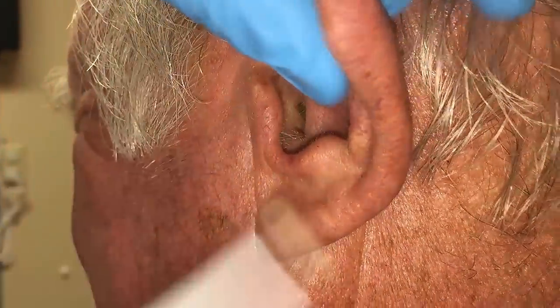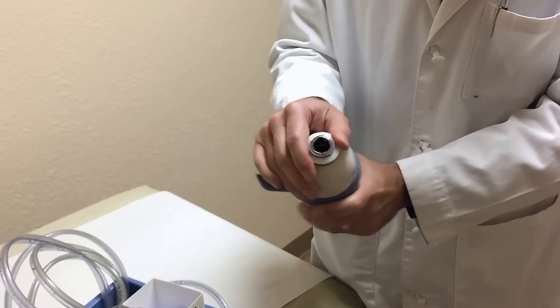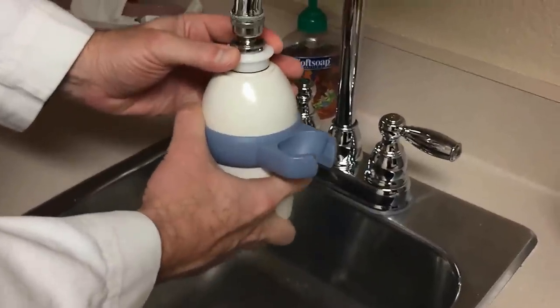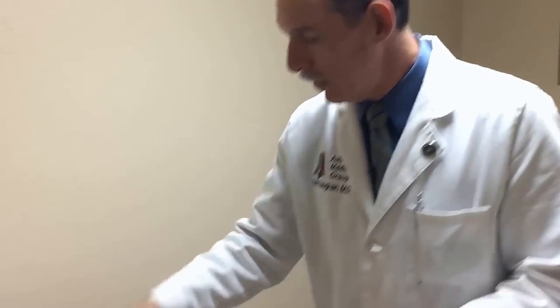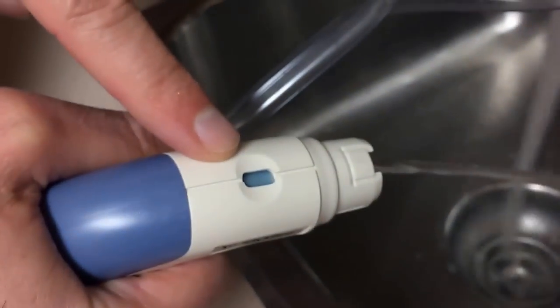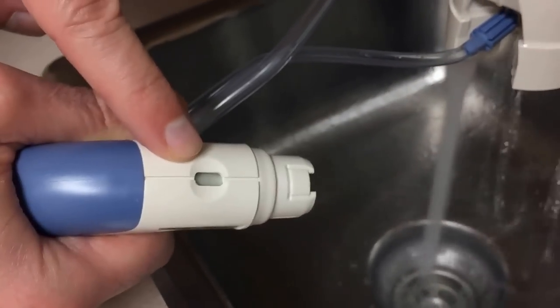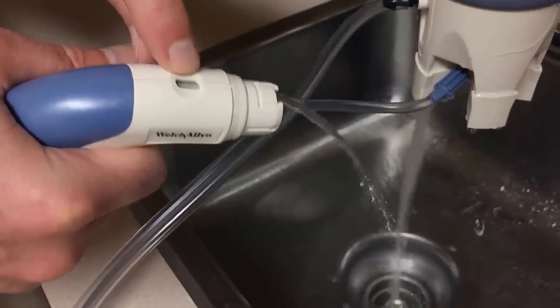The Welch Allen Irrigator System allows you to use water from a faucet. The sink in your exam room actually hooks on with this adapter — you have to screw it into the faucet — and it produces a flow of water at a consistent temperature. You adjust your warm and cold water, and when they reach the right temperature, this little indicator here will turn white instead of blue, and when it does it allows the water to flow. If the water is too hot, the water won't flow; if the water is too cold, it won't flow. So your patient is protected. Also, it limits how high the pressure can get, so you're not afraid that you're going to accidentally rupture someone's eardrum.